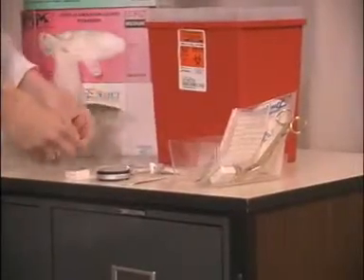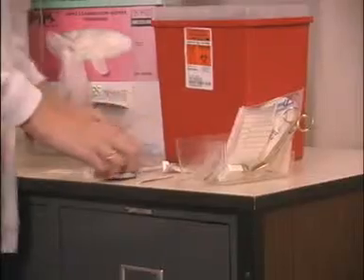Be careful not to touch or rest the blade slot of the puncture device on any unsterile surface.